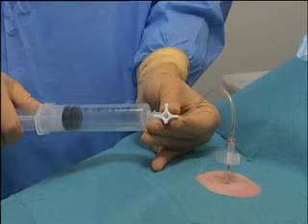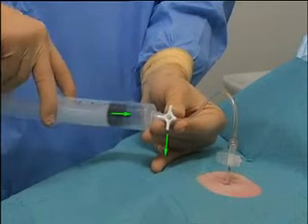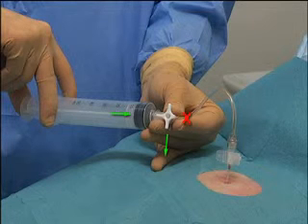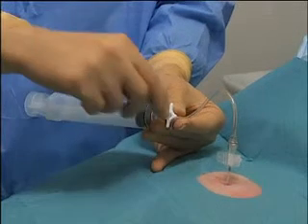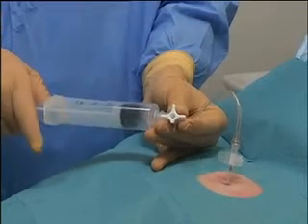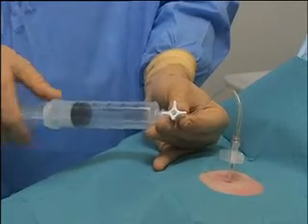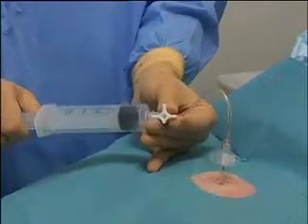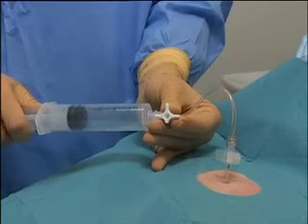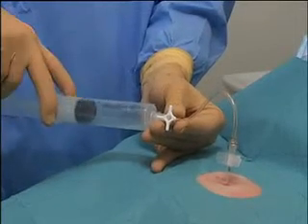To evacuate the air into the ambient air, you must turn the stopcock so that the syringe is connected with the environment, but not with the patient. Make sure that the pleural space is never connected with the environment while you are turning the stopcock. Measure the volume of the air that is aspirated by counting the number of syringes evacuated. If more than 2.5 liters have been evacuated, the procedure should probably be stopped, because such a large volume suggests that there is an air leak.